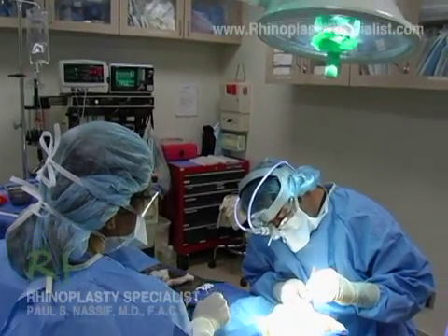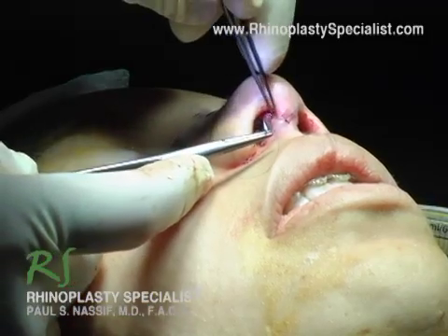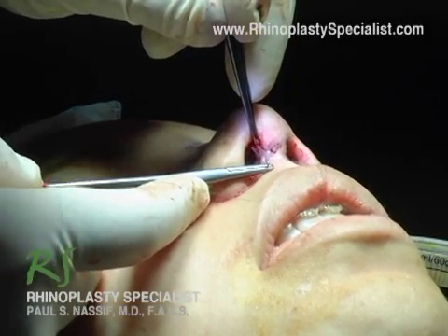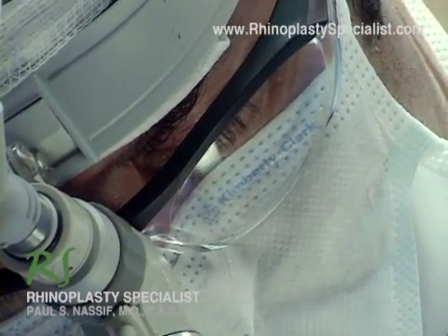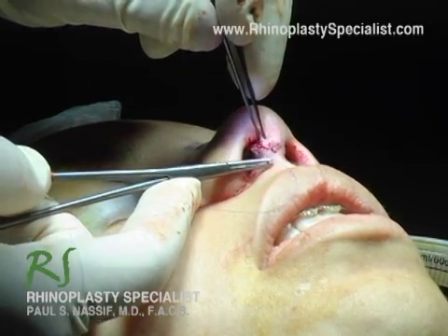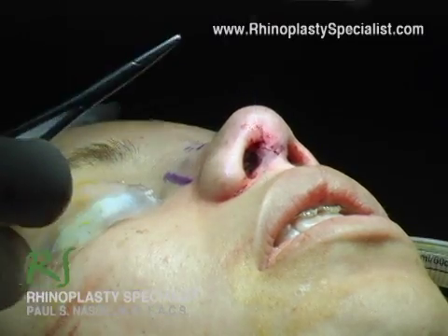We've just finished the major part of the rhinoplasty and we're putting some very meticulous small sutures in the little open rhinoplasty incision. One of the most important aspects of the rhinoplasty that the patient will notice is the little scar between the columella from an open rhinoplasty, and as you can see here right now I'm placing very small sutures to make that incision as perfect as possible.